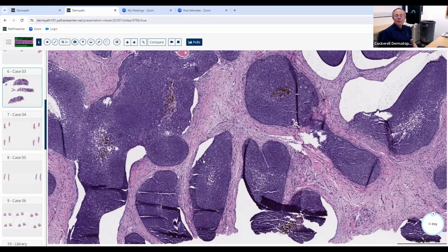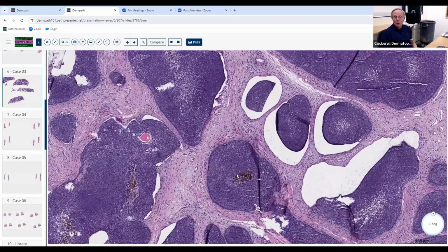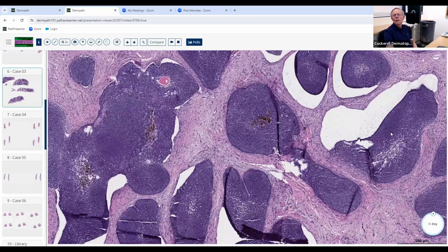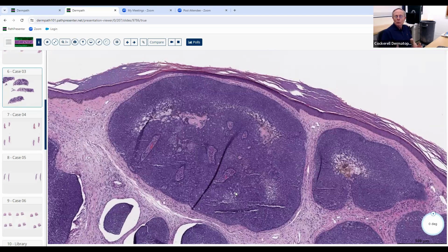These lesions often present clinically as cysts. They're often seen in sun-protected areas. They may be seen in dark-skinned individuals. So we'll often see, say, an African-American patient who comes in with something in the axilla that is thought to be a cyst. The clinician biopsies it, and lo and behold, it looks like this. It's a variant of a basal cell carcinoma that's got this trichoblastic morphology. So you could possibly encounter something like this on the board. It's a little bit esoteric, and I doubt they would show this to you, but just be aware that occasionally you'll get a lesion that has overlap between a basal cell carcinoma and a trichoblastoma.